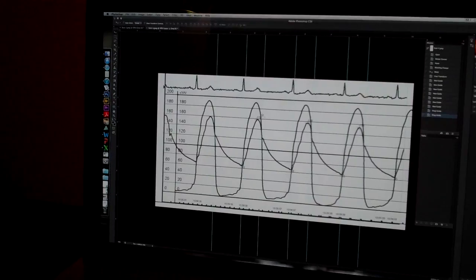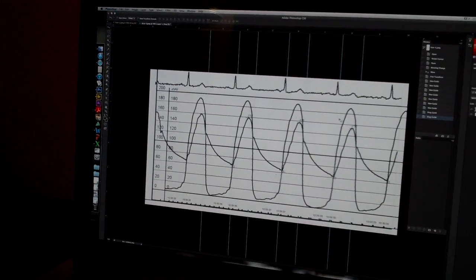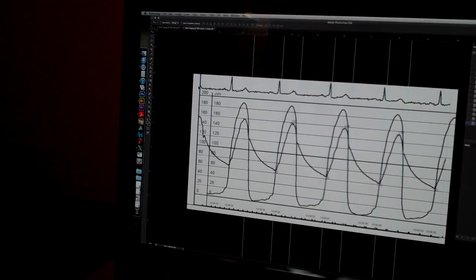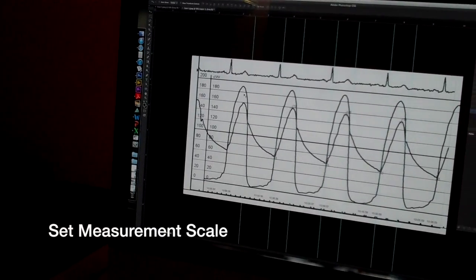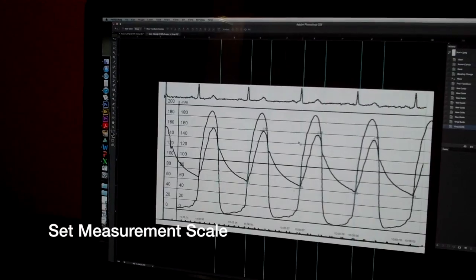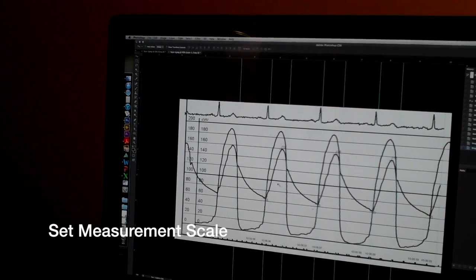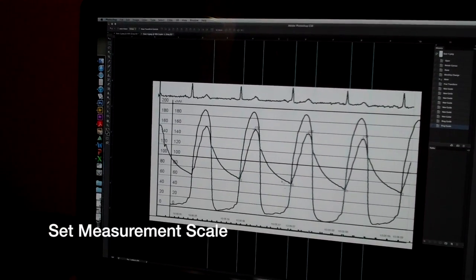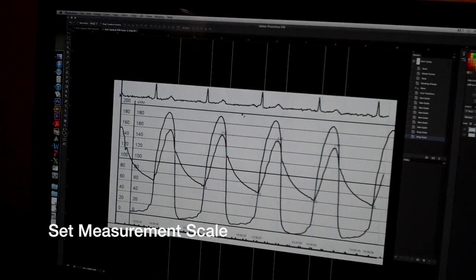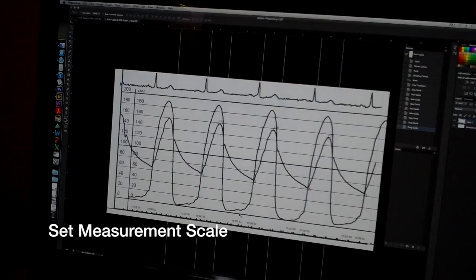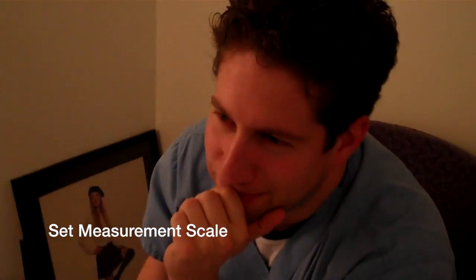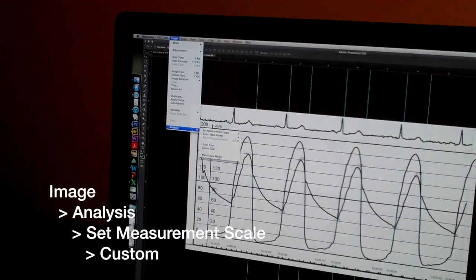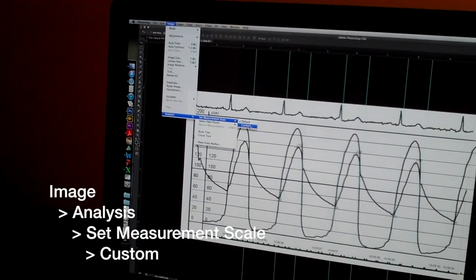So the first thing I need to do for the equation calculation is to calculate these three areas. So CS6 Extended has an analysis package that allows me to do this. The first thing that needs to be done is to set the measurement scale so that the analysis package knows that whatever area it calculates here on the screen is converted to whatever measurement is on this paper. And so my colleague has already measured this dimension from the zero line to the 200 line on the paper with a ruler.